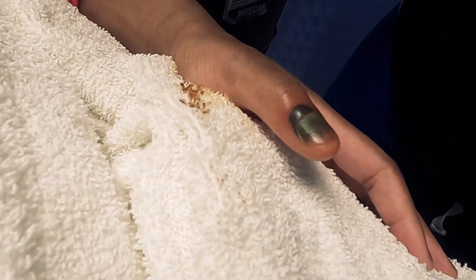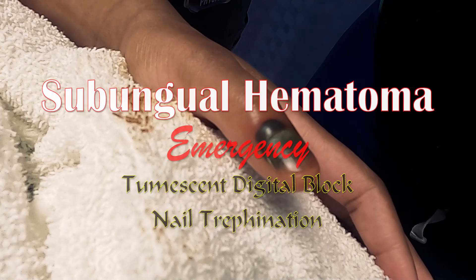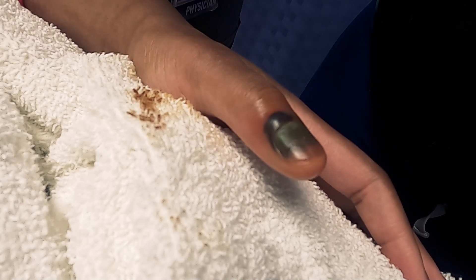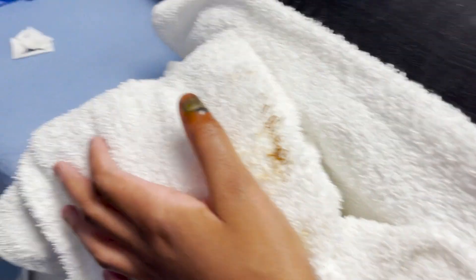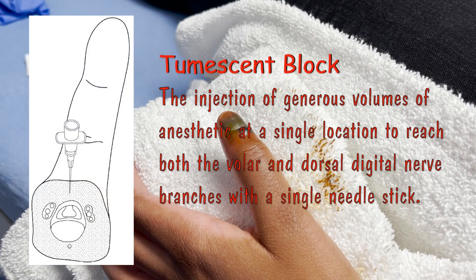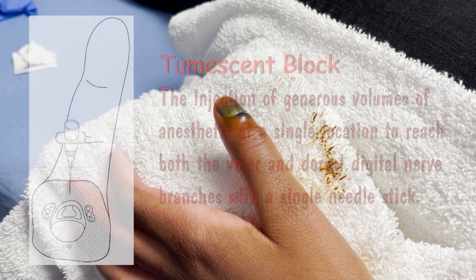The accident was a car door slammed shut on her finger. There's no evidence of any fractures, but she's got this very dramatic hematoma underneath the nail that we're going to drain. So what we're going to do today is a tumescent block — actually a double tumescent block on both ventral and dorsal surfaces to numb her thumb up.